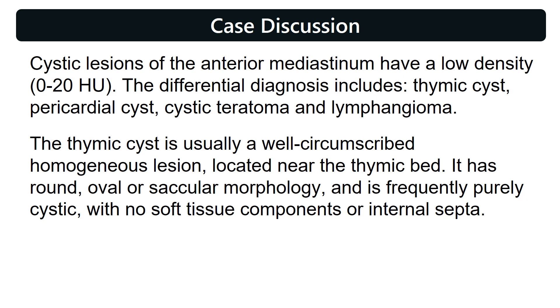The thymic cyst is usually a well-circumscribed homogeneous lesion located near the thymic bed. It has round, oval, or saccular morphology and is frequently purely cystic, with no soft tissue components or internal septa.